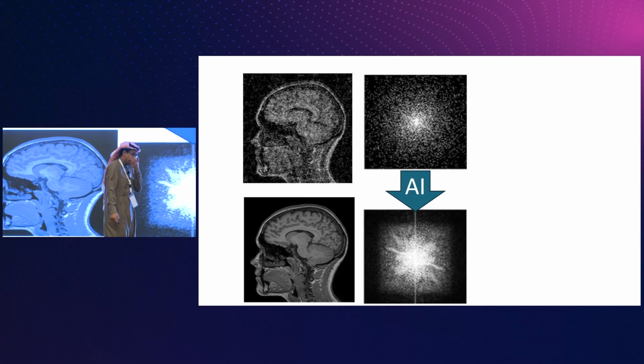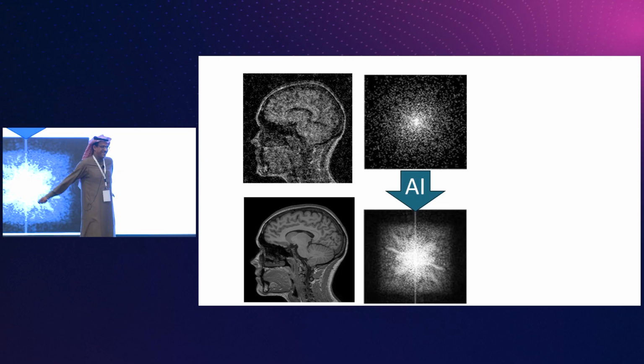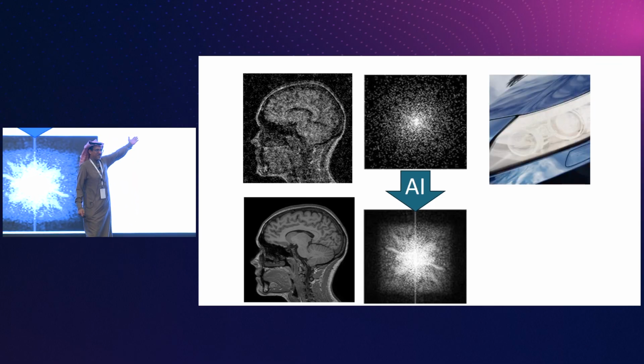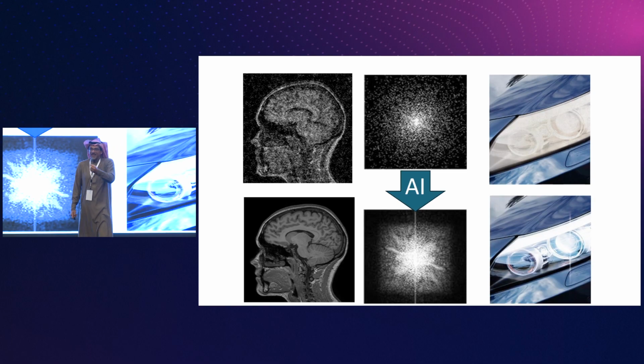Because I can prove it to you with a stupid example. My examples are really, I don't know if you like them. This is a light, isn't it? Okay? What should I do to make it good? Exactly. That's what I did. That's the noise. So I remove the noise, so I have the same light. I remove the noise, and then I have strong light. I have good SNR.